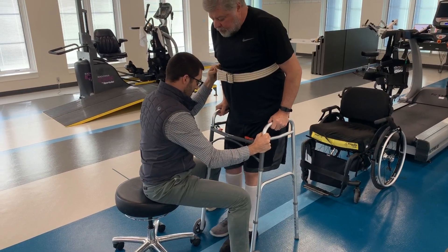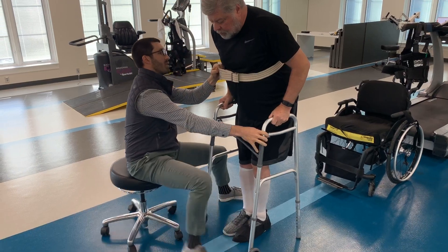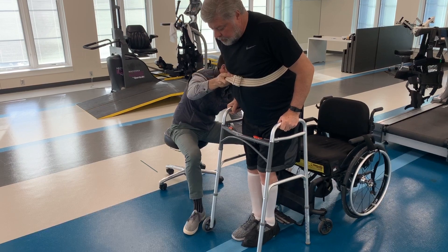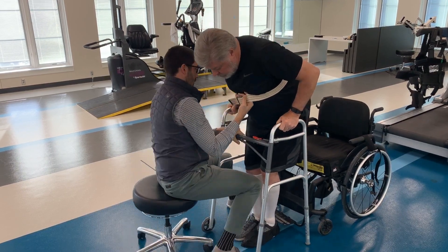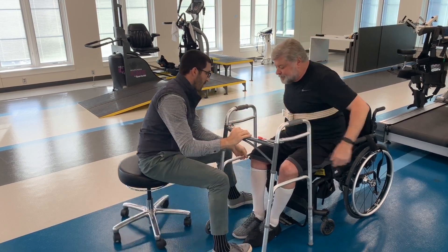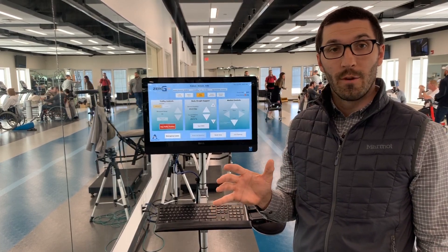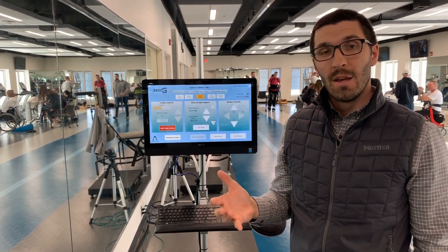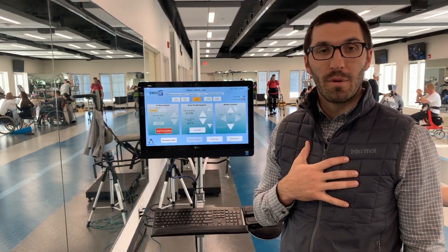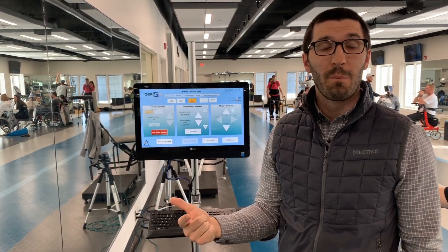Let's get your feet together. Bring the walker forward slightly. I'm going to bring a chair behind you. And stick your butt out there. Good. So John could obviously stand up and he could walk with just the walker and the support I was giving him, but it's not terribly functional right now. One of my goals with him would be to get a ton of repetitions in, in order to drive the motor system to get better.